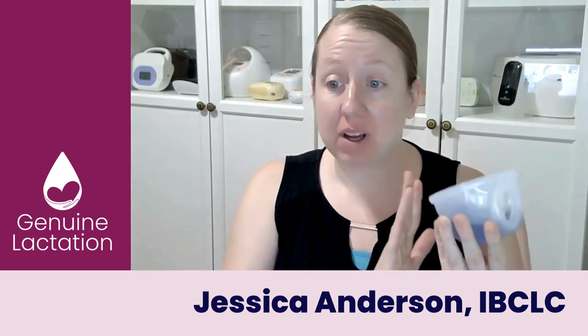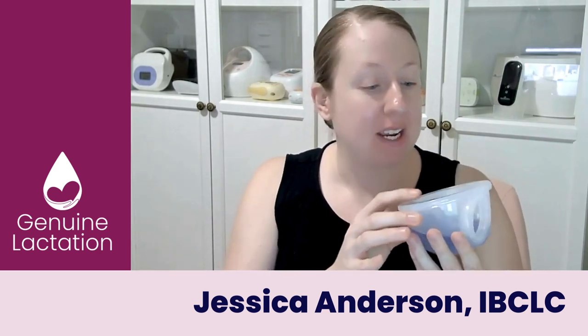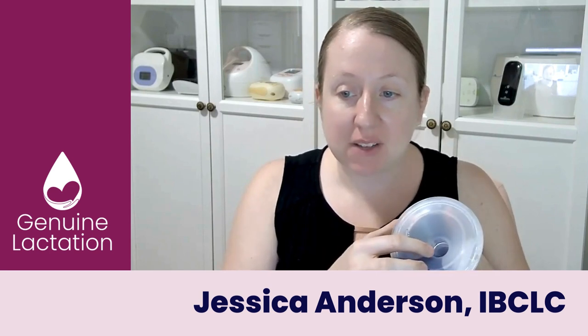Hey guys, Jessica here. So we keep getting questions in the Facebook group about how to pour your milk out of your Baby Buddha cups without making a mess. The big problem that people are having is mostly coming from the little bit of milk that can be left over inside the flange.